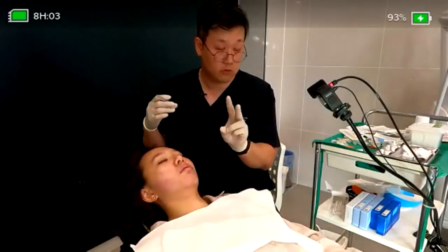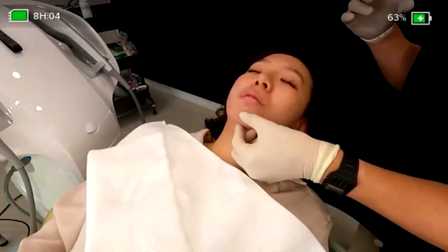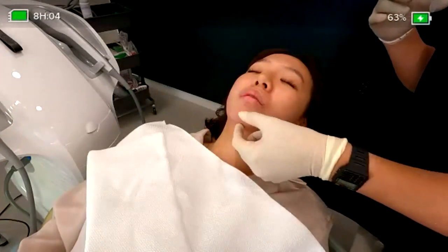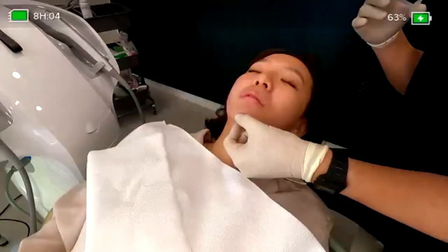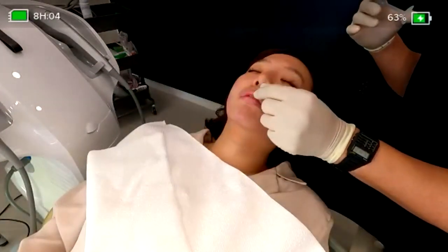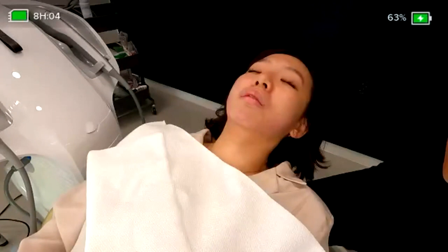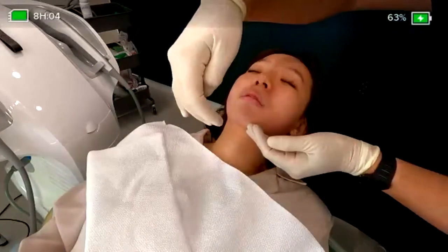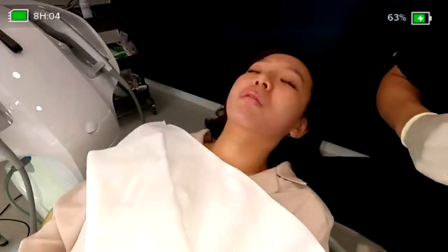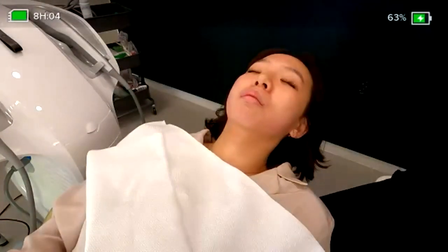The 2 points remaining are here and here and here, but usually this kind of reaction should be determined here first and here next, because we are lengthening the chin a little bit. So the ratio between the upper lip and the lower lip and the chin will be changing. So after the injection, we go for that. The approaches can be done both ways, from the nose direction and in the opposite direction. Anything is available, but usually we are using different kinds of fillers here.